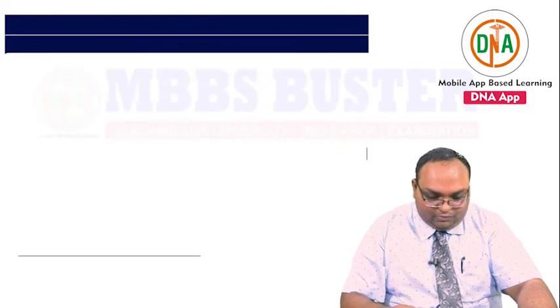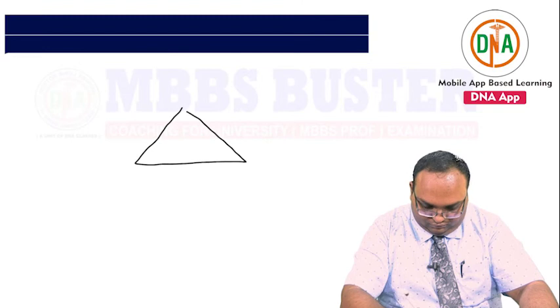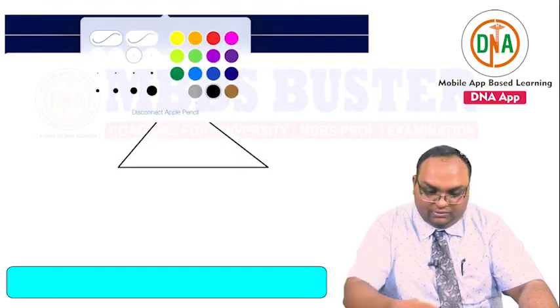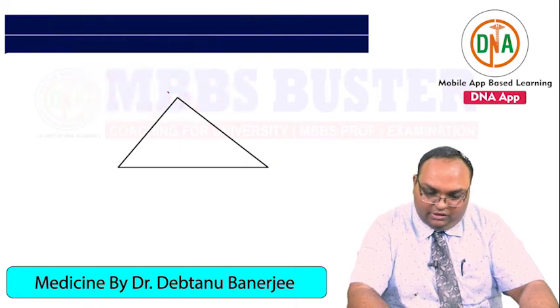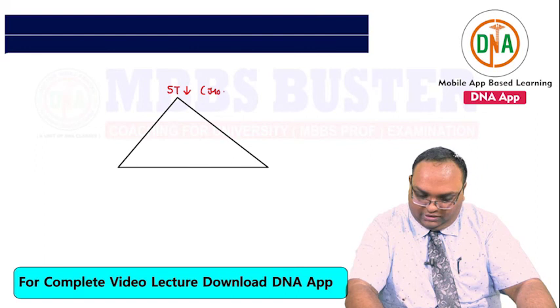So we spoke about a triad of 3 things. What are those 3 things? Firstly, you have an ST segment depression, which is your hockey stick sign.